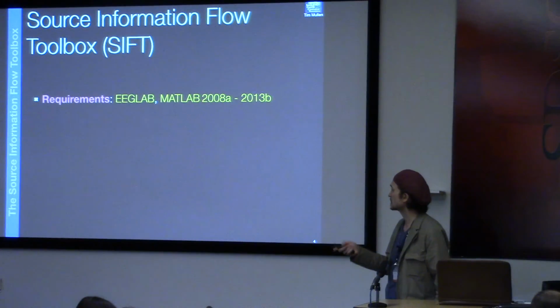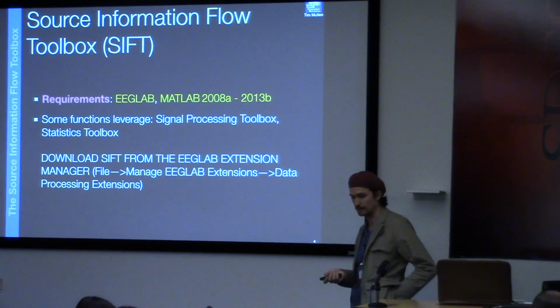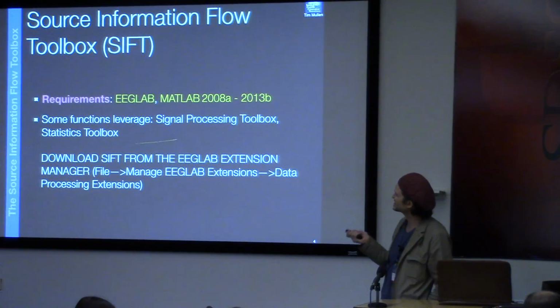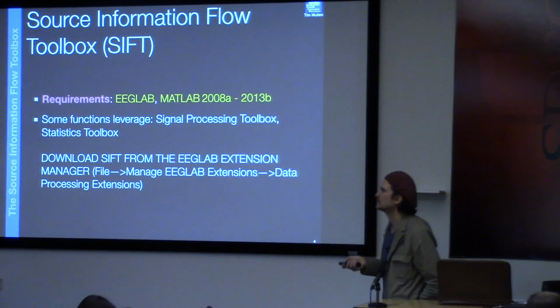So that's something that unfortunately you'll need to either pair up with someone who has a version of MATLAB of that sort or grab one before the hands-on sessions. Some of the functions may leverage functions from Signal Processing Toolbox and Statistics Toolbox. It's rare that you'll encounter that. If you have them, great. If you don't, it should be okay.